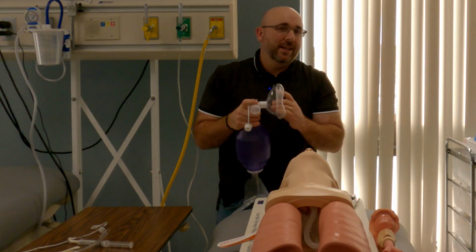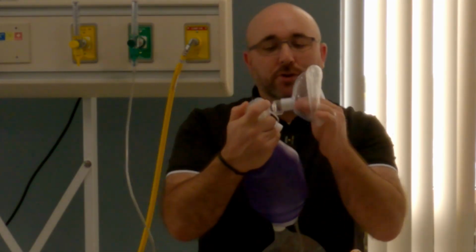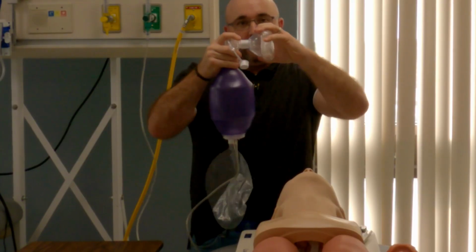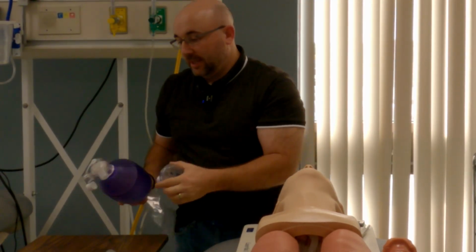And then also, really important, know where this piece goes. I know, but in the rush, sometimes it's difficult. Sometimes it doesn't have this cover on the side. People will try to attach it there. It will not attach there. It will only attach here. While they're intubating, you're going to pull this off so that you're ready to be able to ventilate the patient.